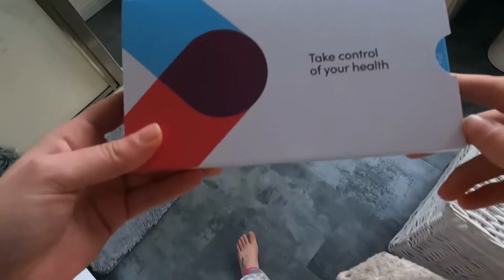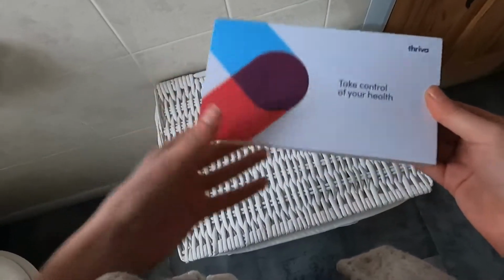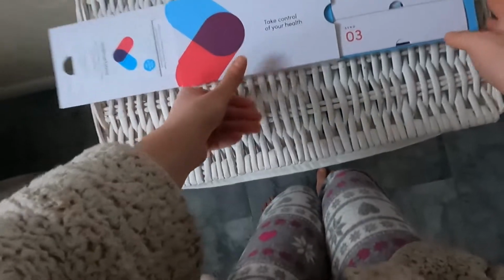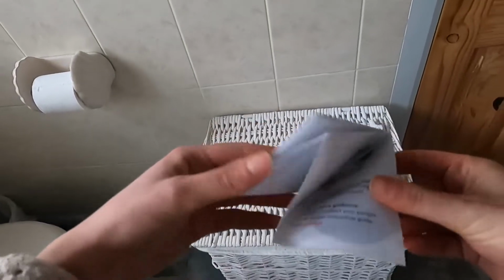So what you do is you lay out the kit on a table that's lower than your elbow. This is so the gravity allows the blood to flow out easier. Grab a clean tissue and fill a large bowl or the sink up with hot water. You wash your hands and then prepare your kit. So remove the cap from the tube, and there's like a little hole in the box that you can sit it in, and stand the tube upright.